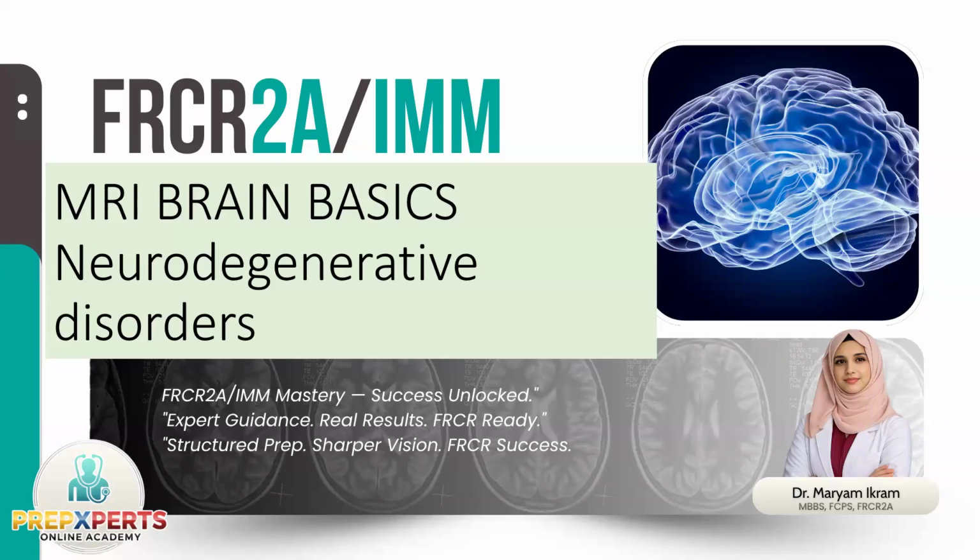So I'm going to go into some very basic concepts that will help you in the exam definitely, because most of the questions in the exam are like you might not have seen those while practicing, you might not have read those in your crack the code or even in your big books, but if you know the basics and your concepts are very clear, crisp and strong, you will be able to get those. So do go through these basics.